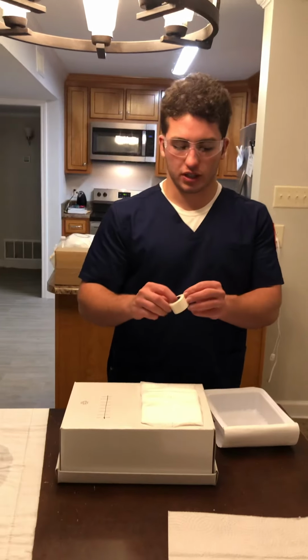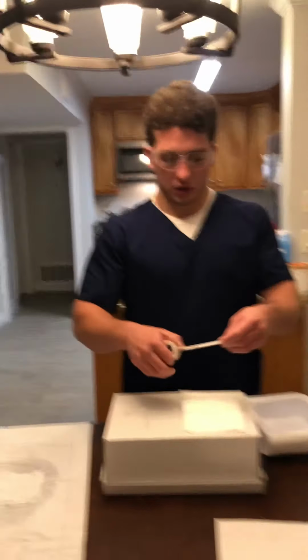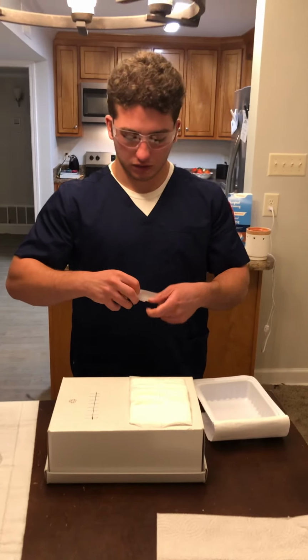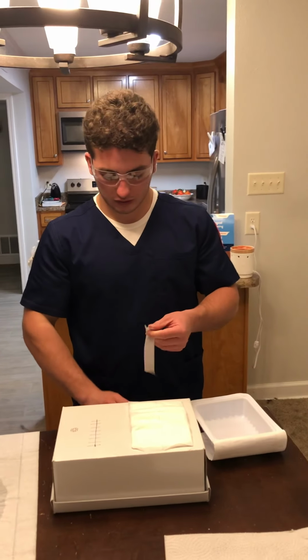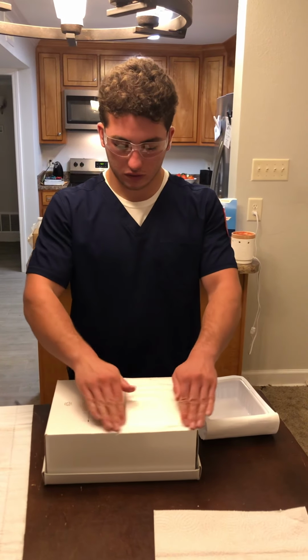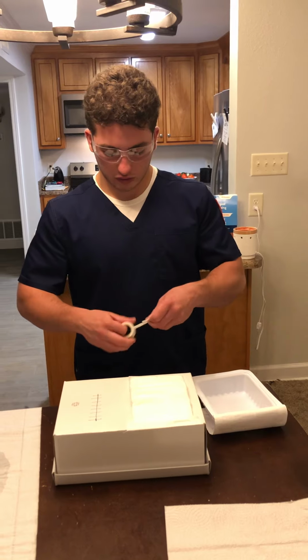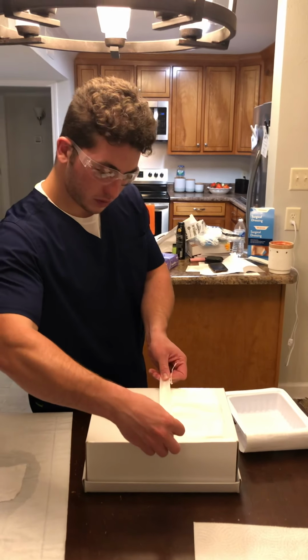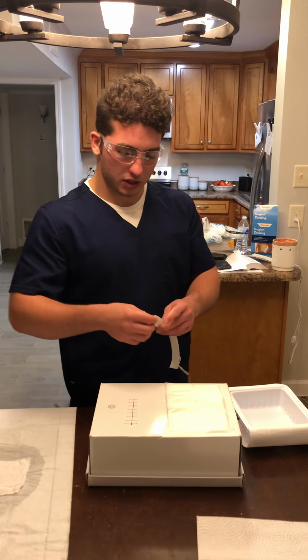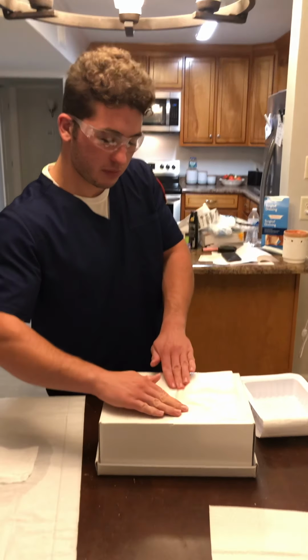Now going to measure and tape down all of the edges of the wound. Measure. I'm measuring to ensure that I do not waste tape and does not pull on the packaging when I go to tear the tape.